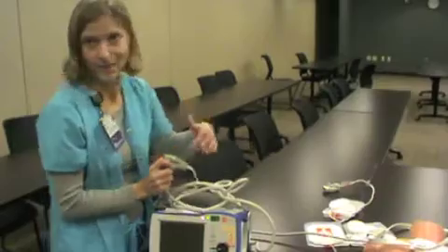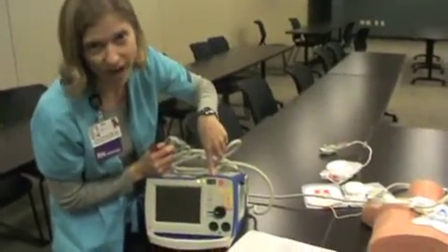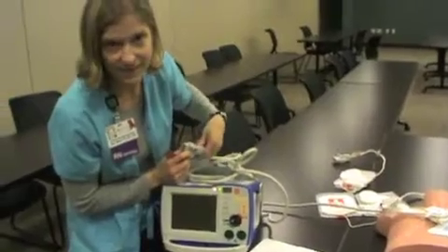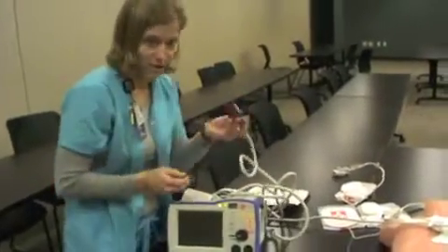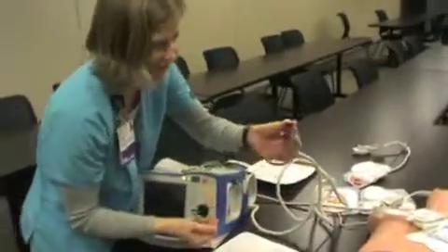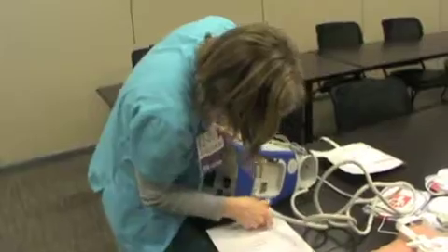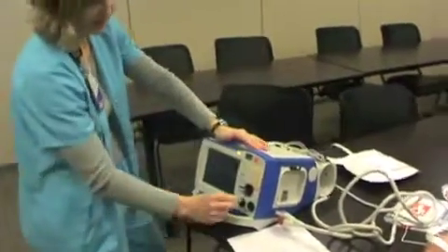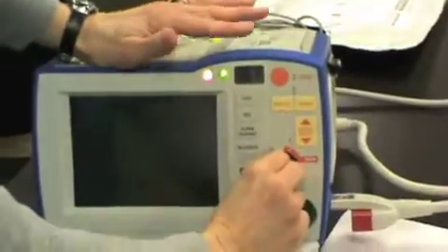Now, last night it wasn't plugged in, so instead of a green check mark here, we have a red X saying that it failed its self-test because it wasn't plugged in. So, if that ever happens to you, this is how you get rid of it. You take this therapy cable and plug it right here into the side of the machine and deliver that 30 joule charge right into the machine itself.